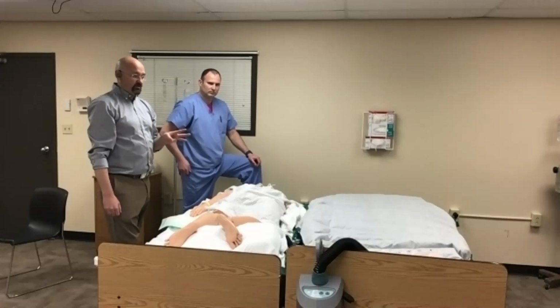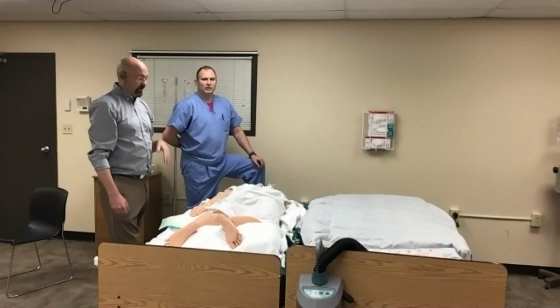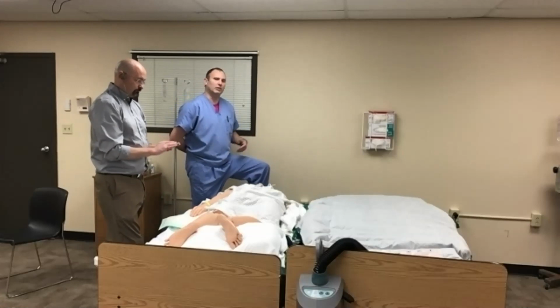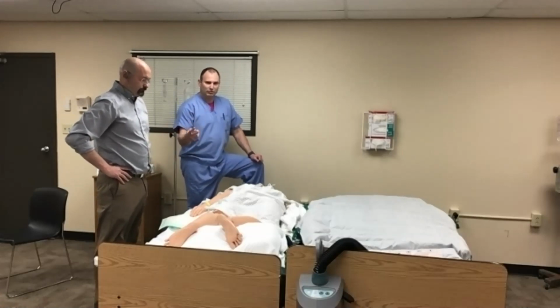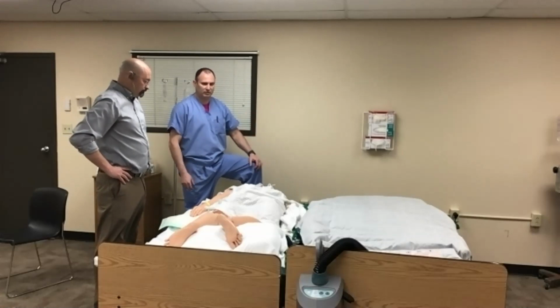200 to 300 pounds, 3 people, 300 to 400 pounds, 4 people, 400 to 500 pounds, 5 people, and so on. And realistically, you're going to have more people in your ICU room to manage this. Likely anesthesiology or respiratory to manage the vent, and then you're going to have 2 nurses, 2 aides, a PT, 2 PTs, whatever it might be.